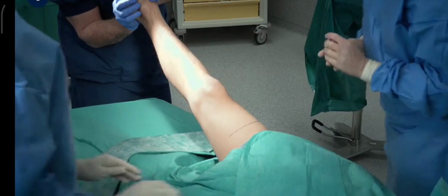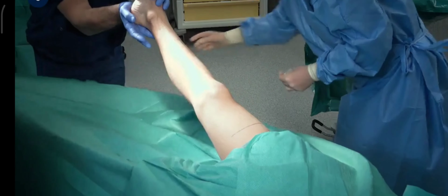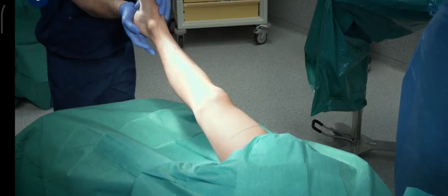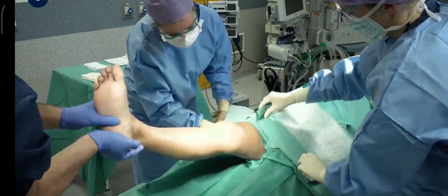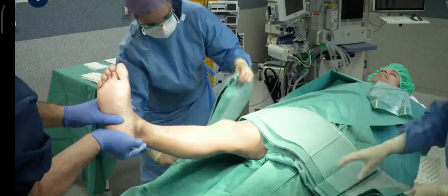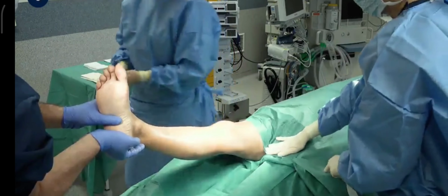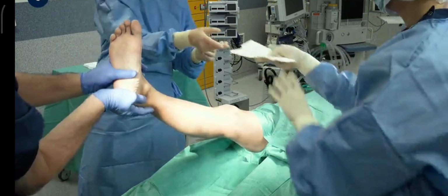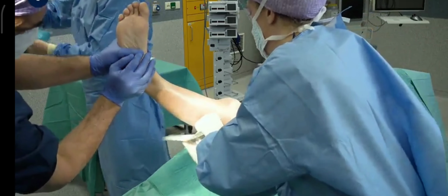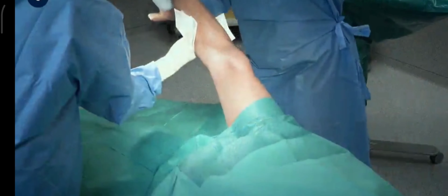With the sterile field extended proximally, the U-sheet is unfolded distally, extending the sterile field in that direction. A large drape is placed over the U-sheet and used again to expand the sterile field proximally. Attention is then turned to the foot. The scrub nurse hands the surgeon a sterile paper towel, which she uses to support the lower limb in the area that has already been cleaned.